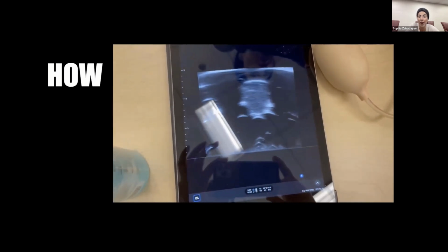I did find on my model as well that I was not able to deposit the anesthetic due to how dense the ballistic gel was. When I tried to deposit it, it all flew back in my face. So it's just another component to think about, particularly if that's something that's really important in your model. That would be a barrier that you would have to try to overcome.